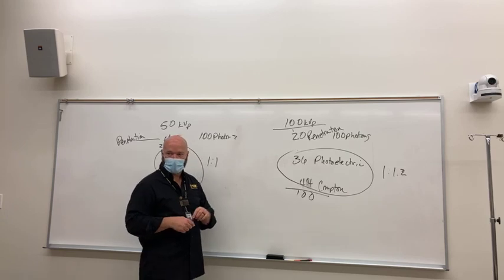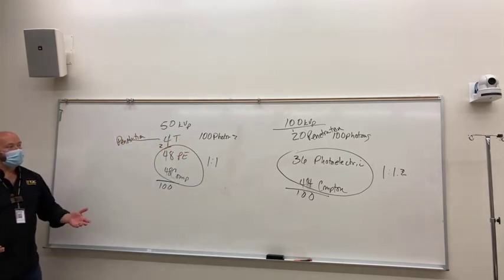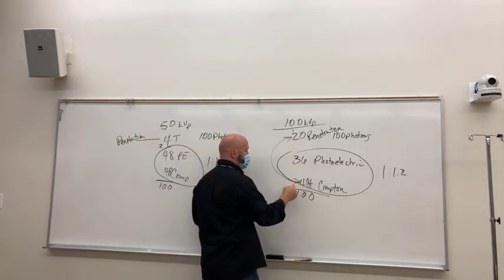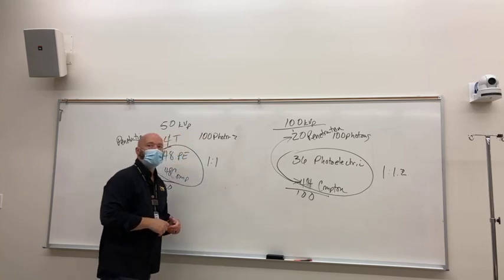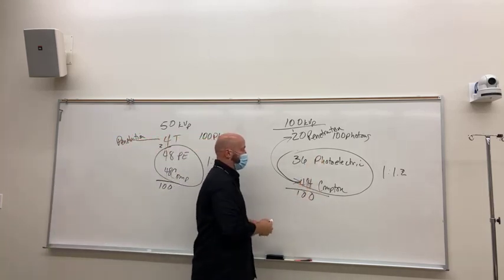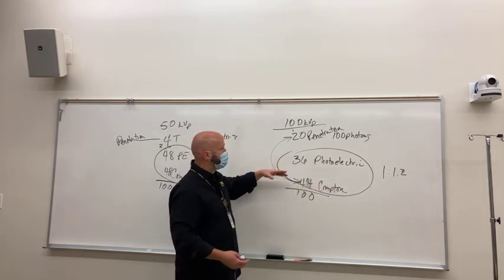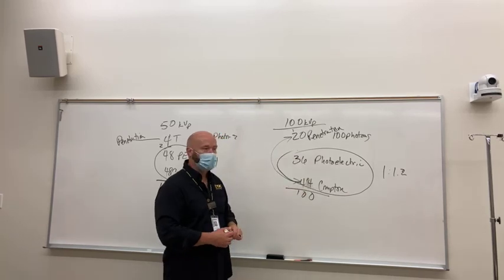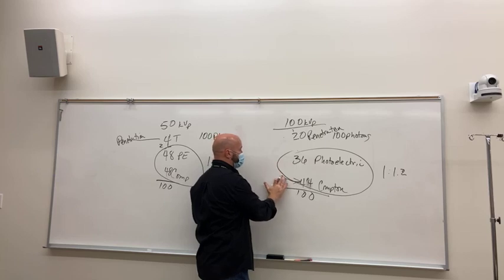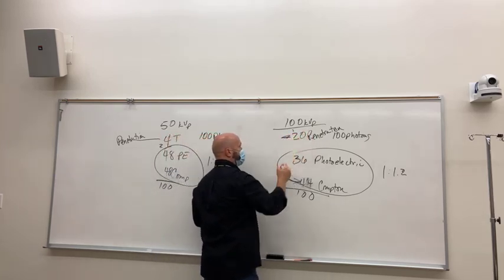So is penetration and absorption kind of like inversely? Exactly, okay. So penetration, in this case, you know, what penetration truly is both of these. And again, some of the Compton may interact, but true Compton that penetrate through the patient and strike the image receptor, both of them are penetration. But I just don't want you to be confused on that. But when we talk about penetration, these are the numbers we're talking about here.